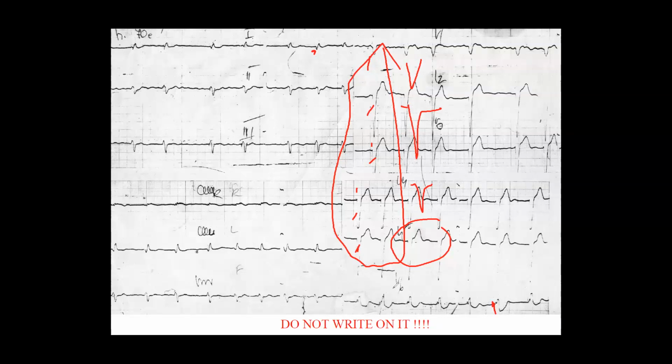Now, maybe next time I will show you a case when we had left bundle branch block together with an MI, an anterior MI. But this is not that. So first you have to think about it. Okay, I found it and I will show it right away.